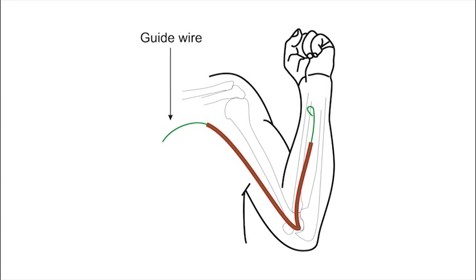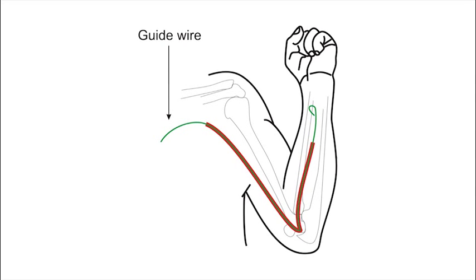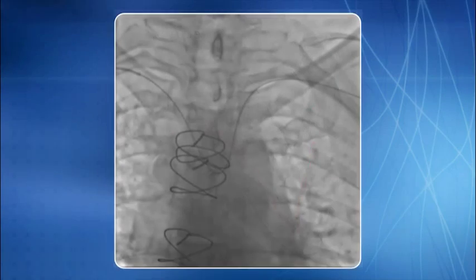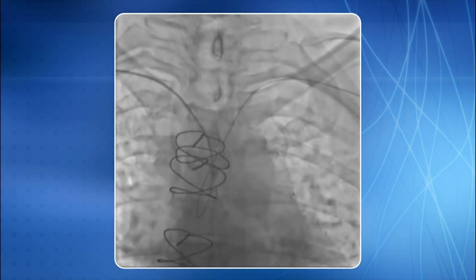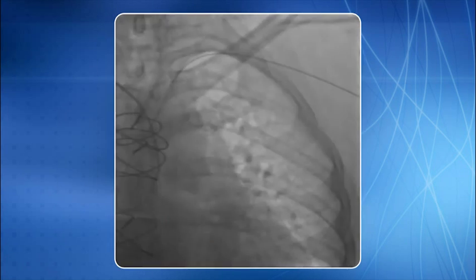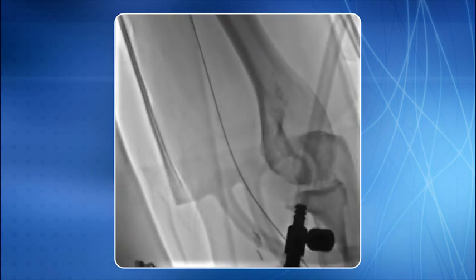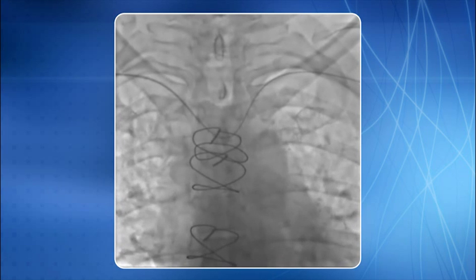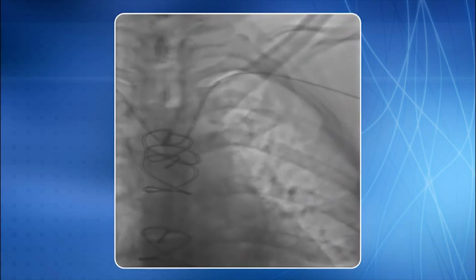I am now going to show you a technique developed by us which is dependable and reproducible. In this example, despite the distal end of the guide wire positioned deep in the left ulnar artery, the assembly has a tendency to flip repeatedly into the ascending aorta. A BP cuff was tied over the left arm and inflated to 200 mmHg — higher than the patient's systolic pressure — to compress the brachial artery and trap the guide wire successfully. This trick allowed negotiation of the catheter into the left subclavian artery without flipping of the assembly.